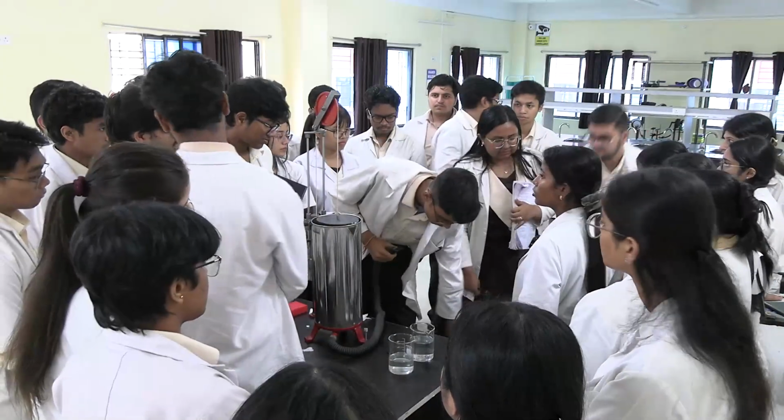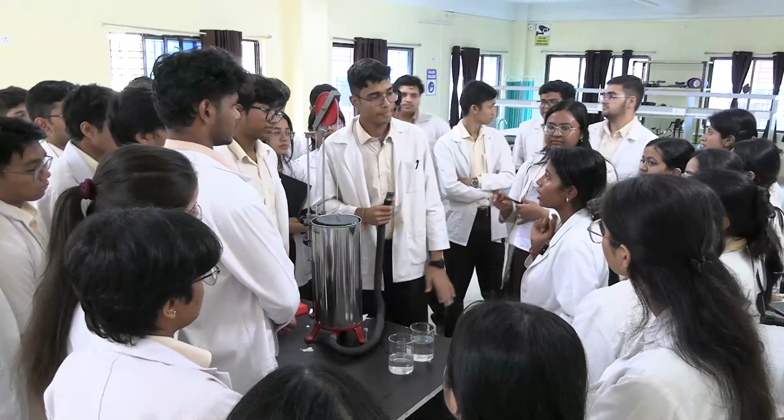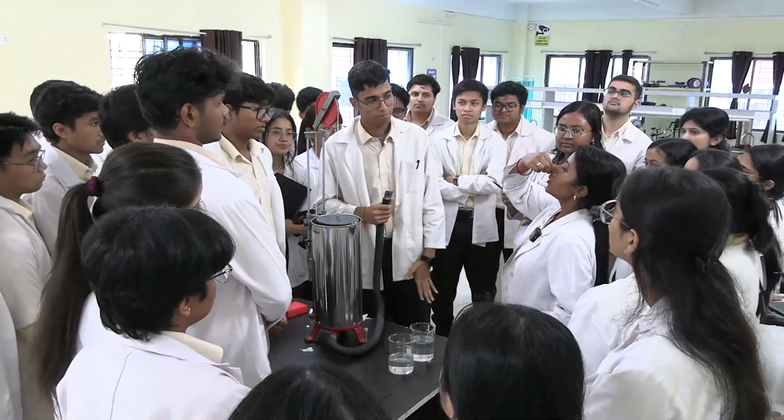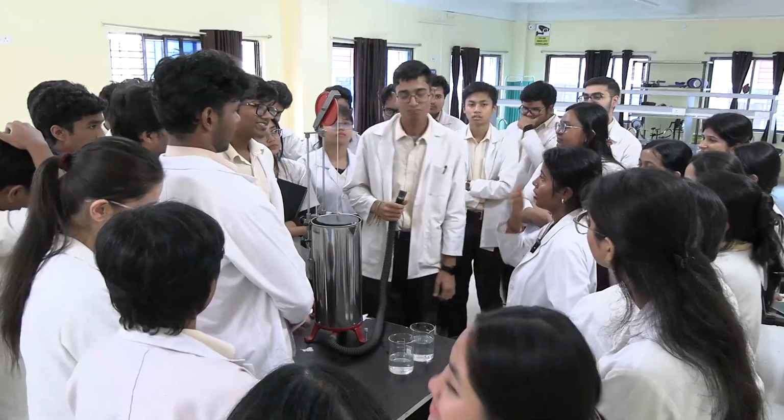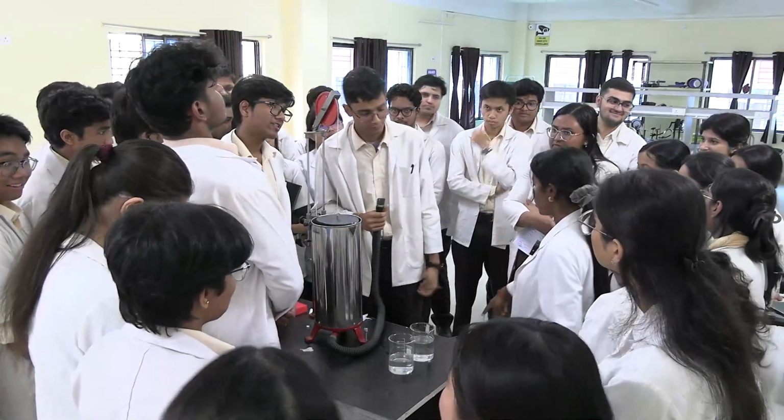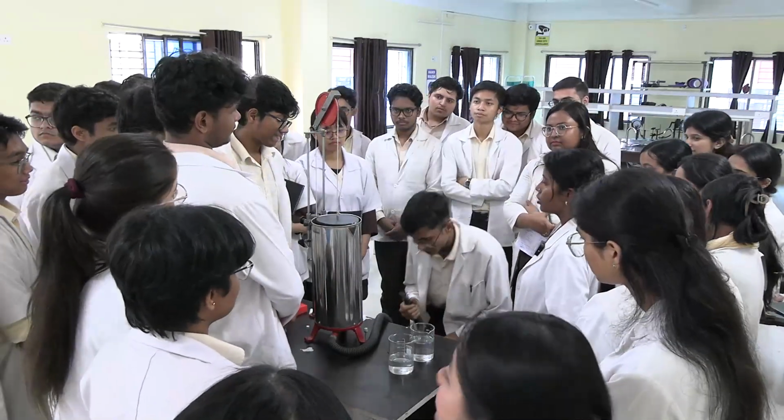So ideally, I will just show you one demonstration. Okay. So normally, you have to exhale as much as you can, forcefully. Okay. Better, do it sitting. So there will be a difference.